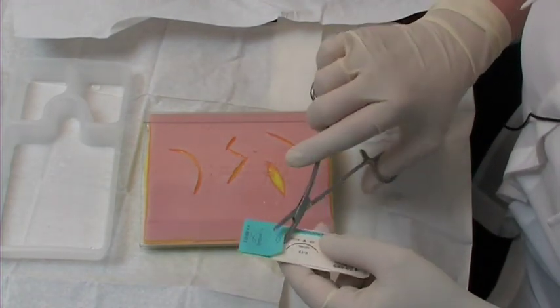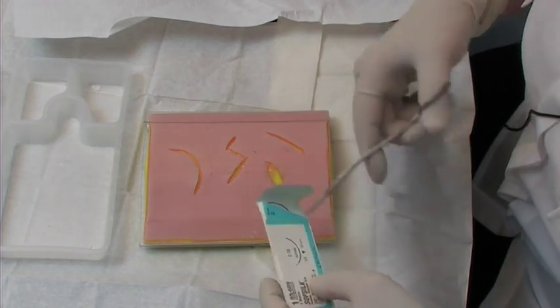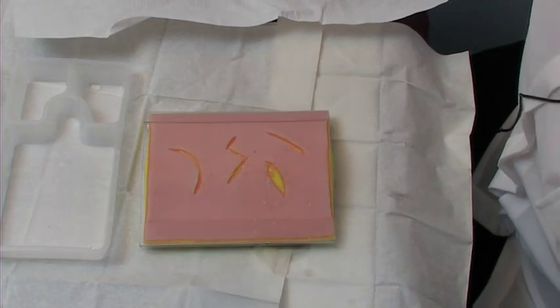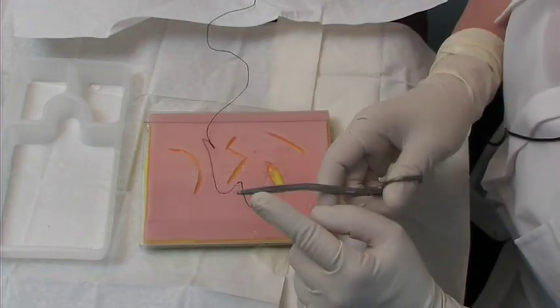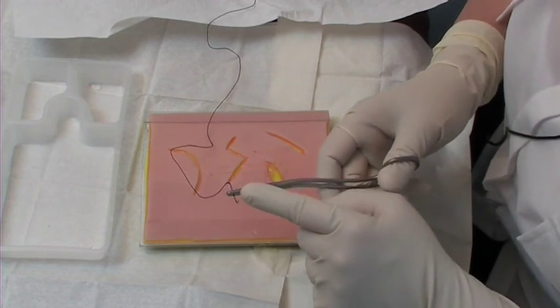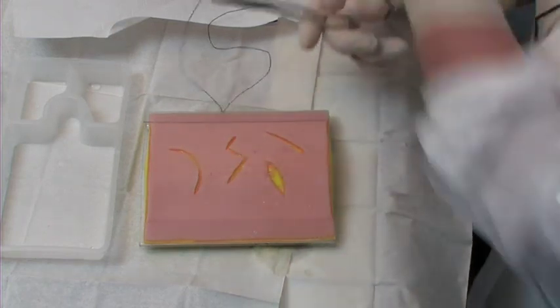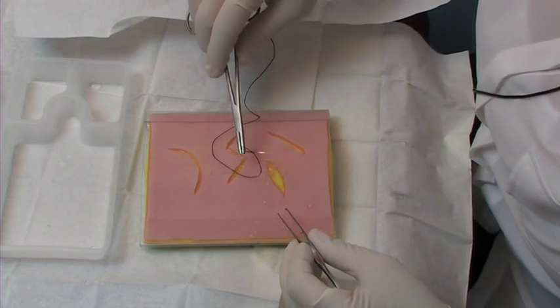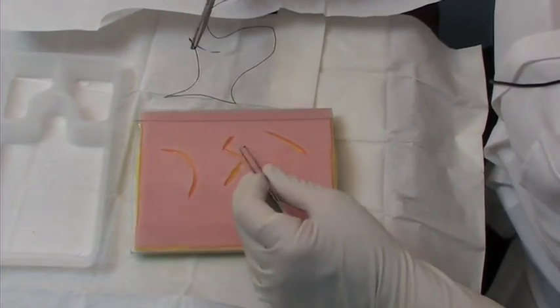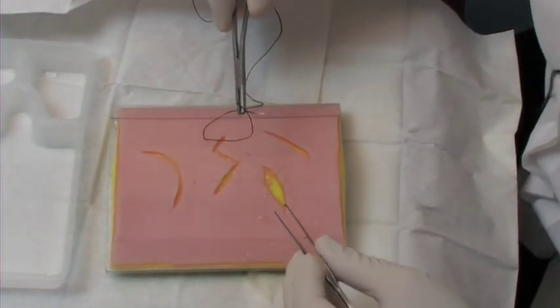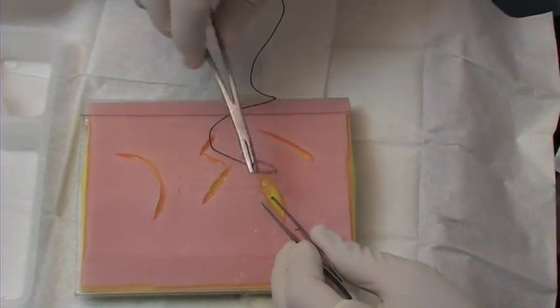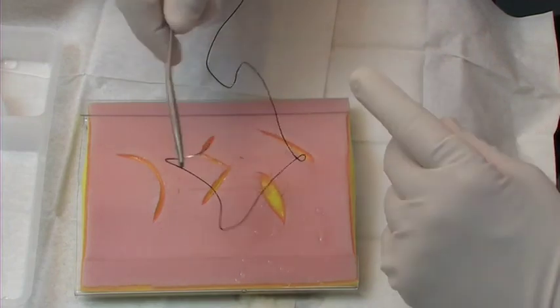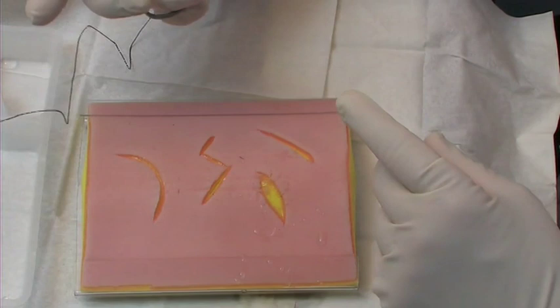Take a forceps and I open my suture. In this case I have a silk suture. The important thing is to take, pull it out. My forceps is holding it about in the upper third of the first straight part of the needle. And then I start suturing. You can see that there's quite a lot of tension in this suture, unlike these other sutures which are quite easy to close. So I want to start approximating and taking the tension off. The movement when I use the needle is a wrist movement, not with my fingers. Because I hold it like that.